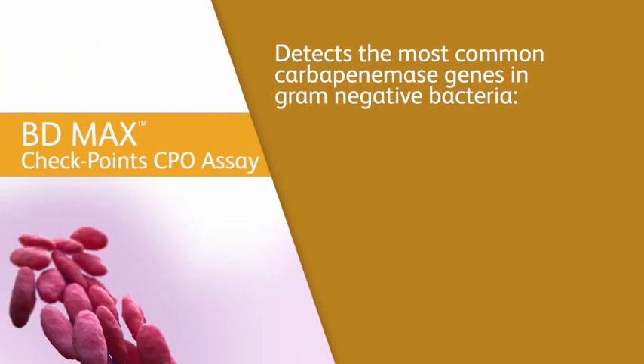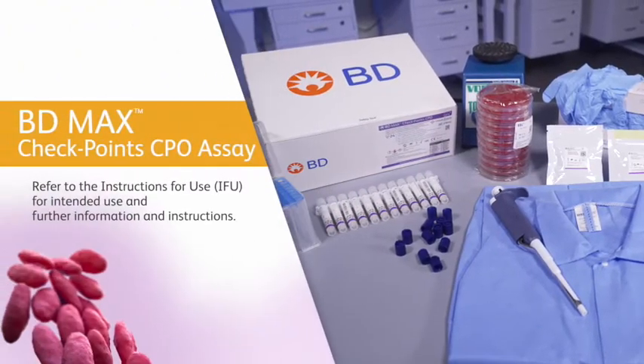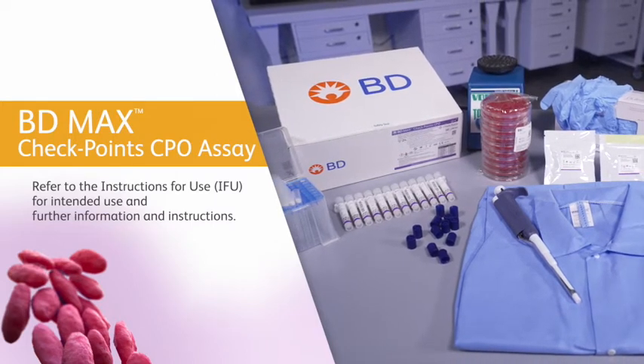The BDMAX Checkpoints CPO assay detects the most common carbapenemase genes in gram-negative bacteria: KPC, NDM, VIM-IMP, and OXA-48. For additional instructions and information, always refer to the BDMAX Checkpoints BDMAX system user's manual and the assay-specific instructions for use.